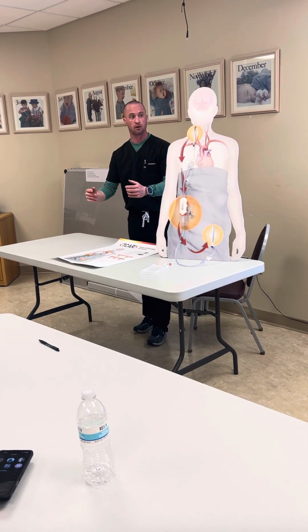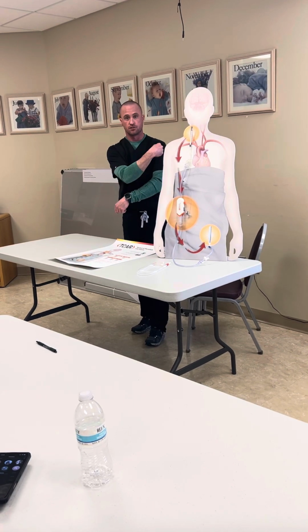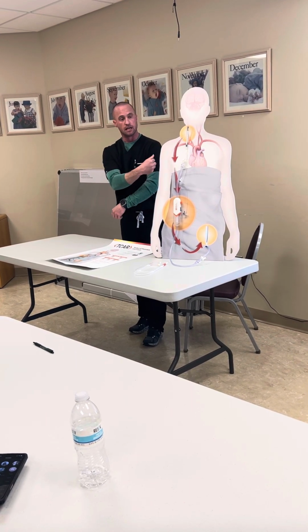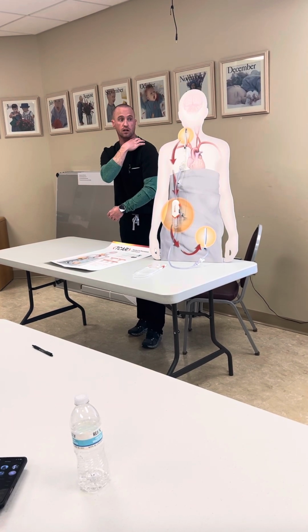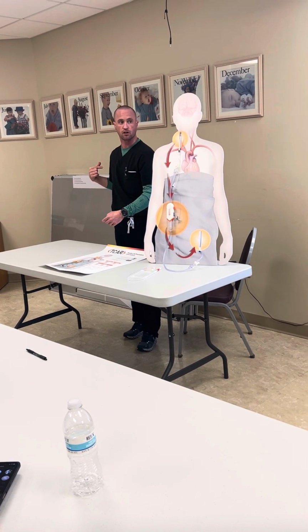Usually, and it's the same side, whether Dr. Reiser's working on the left or right, the C-arm's usually coming in on the left side of the patient. He may come over and do the cut down if we're doing the left. If it's a big patient, he may stand on the left and just do the cut down, but for all of his ballooning and stenting, he'll come stand on the right.